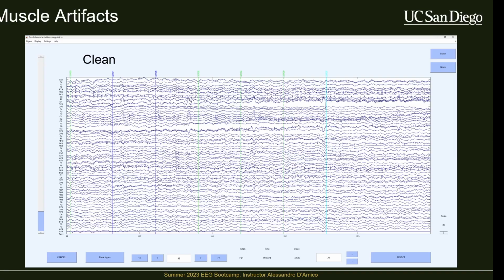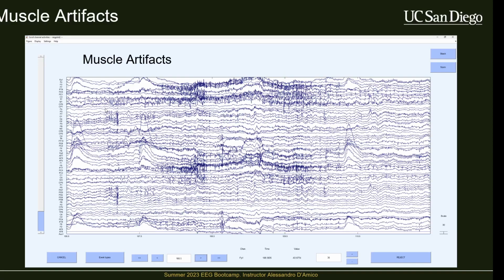We're seeing eye blinks. You can see these nice little bumps, or what look like blinks. This might even be something related to heart and not blinks. I don't know. But we're not seeing a lot of muscle artifacts, and I can tell because when you see muscle artifacts, you see these massive high frequency spikes. So these are usually very apparent. Sometimes it can be much larger than this. This was during an actual experiment, so when the subject is taking a break, they're not really moving around that much. But before you start recording data and you just look at activity from people, it's all over the place and it's crazy.